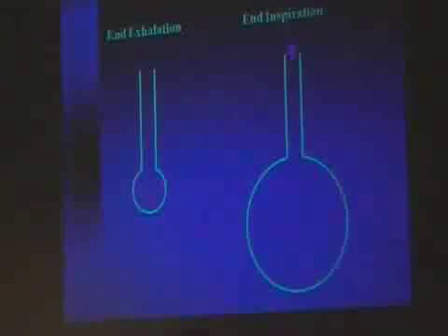Okay, during tidal ventilation, the alveoli are going to, at exhalation, be small, and on inhalation be larger as we move that tidal breath in and out of the lung. The purpose, as we talked about last time, was to do that without damaging the lung, doing that by maintaining optimal mean airway pressure, and doing that by using correct tidal volume.